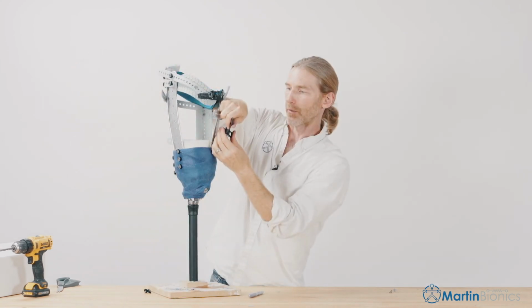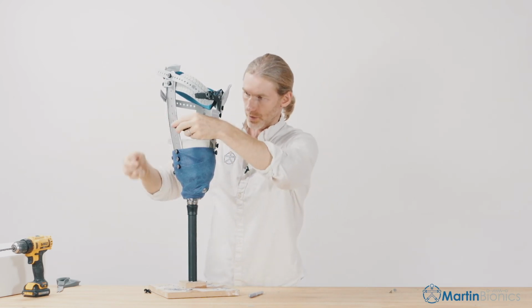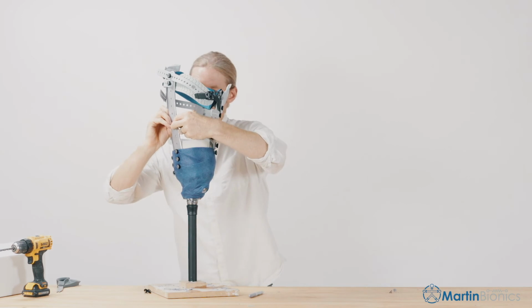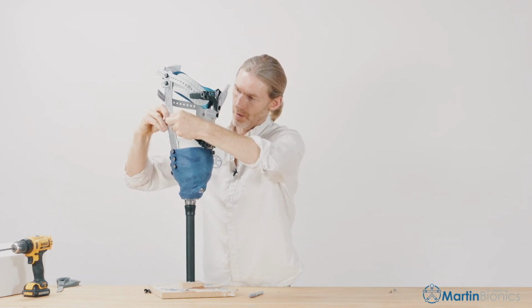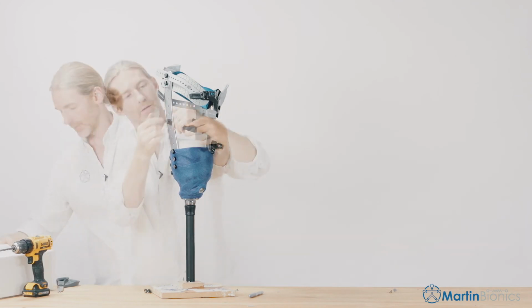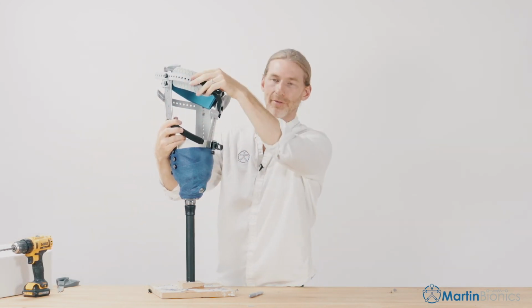And again, this second ratchet is not always needed. Just for really long limbs, if you want some extra tissue containment on the distal anterior half, you certainly can use it. All right, and if we need to have something similar to this where we have the air hammock pedal underneath, we can incorporate that as well. Otherwise, we are fully assembled. Here is our CX hybrid socket ready to fit to the patient.